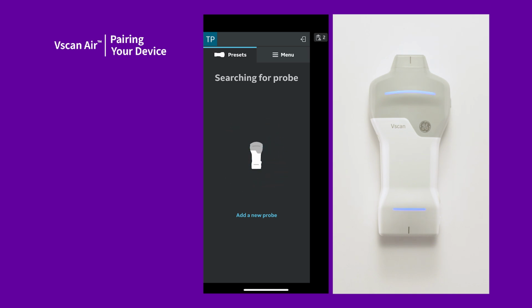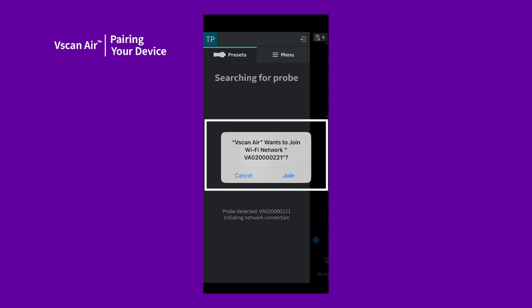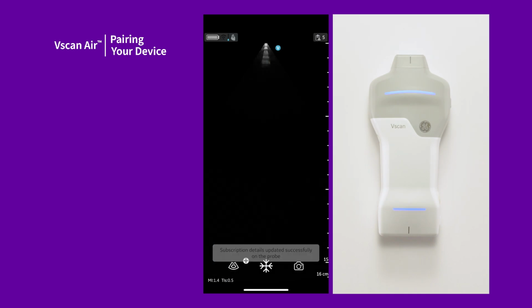On Android devices, the user is quickly taken to the image screen to start scanning. On iOS devices, the user needs to confirm pairing before the screen will change to the scan screen. Once paired, you are ready to scan. The connected and active side of the probe will display a steady blue light.